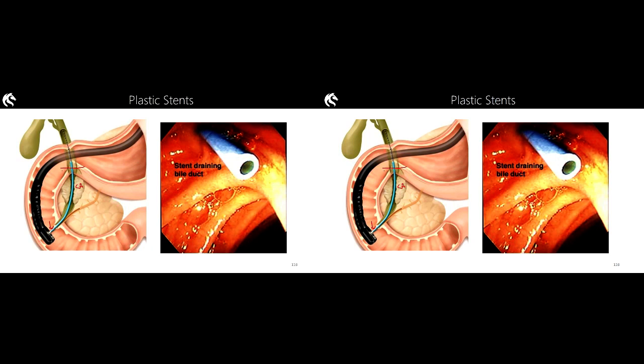Now, these plastic stents start out in life, once again, as a tube. But these ones are short, you can see them there, and basically, we'll put a catheter into the patient's bile duct and then push the tube over the top. These plastic tubes have got little flanges on them, little spurs of plastic that stick out like that, so that when we push them into a position, those flanges dig into the wall and stop it falling out. All right, simple as that.